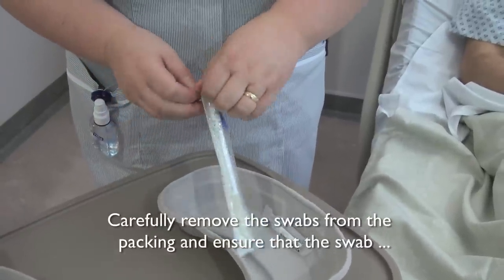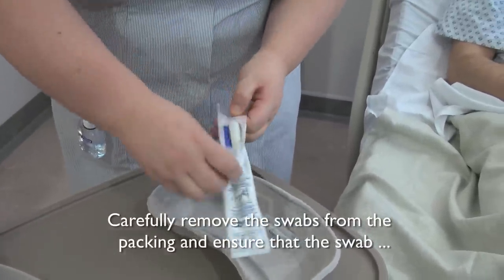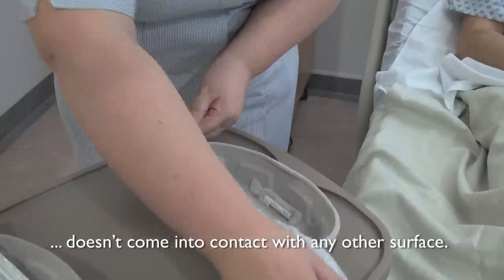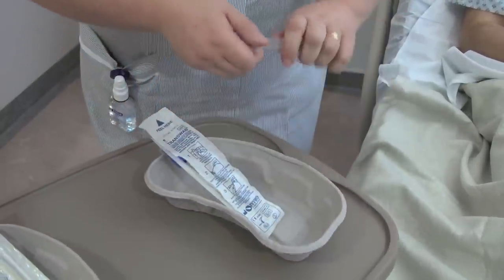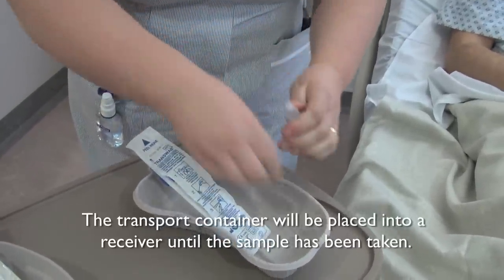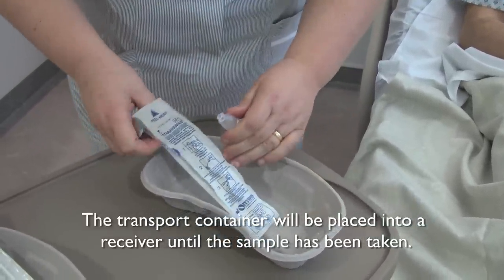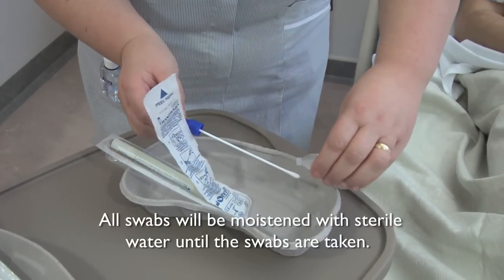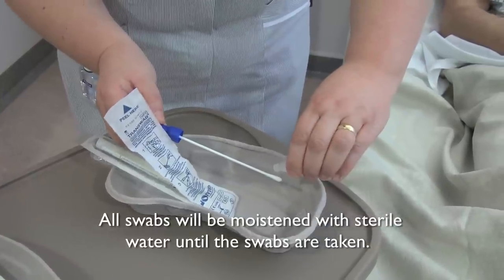Carefully remove the swab from its packaging without letting the swab come into contact with any other surface. The transport container will be placed into a receiver until your sample has been taken. All swabs will be moistened with sterile water before samples are taken.